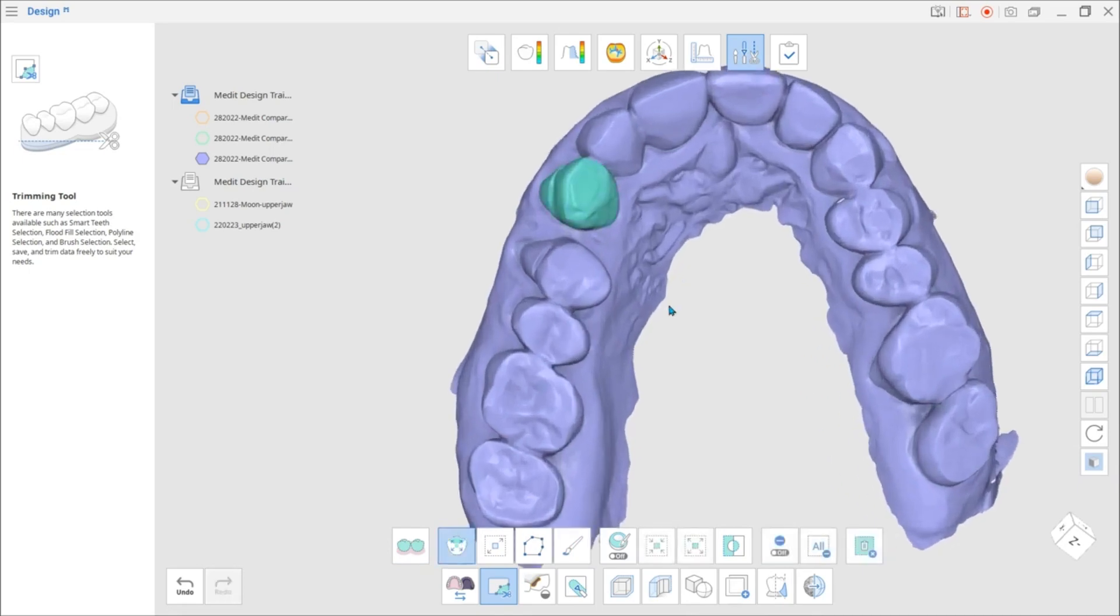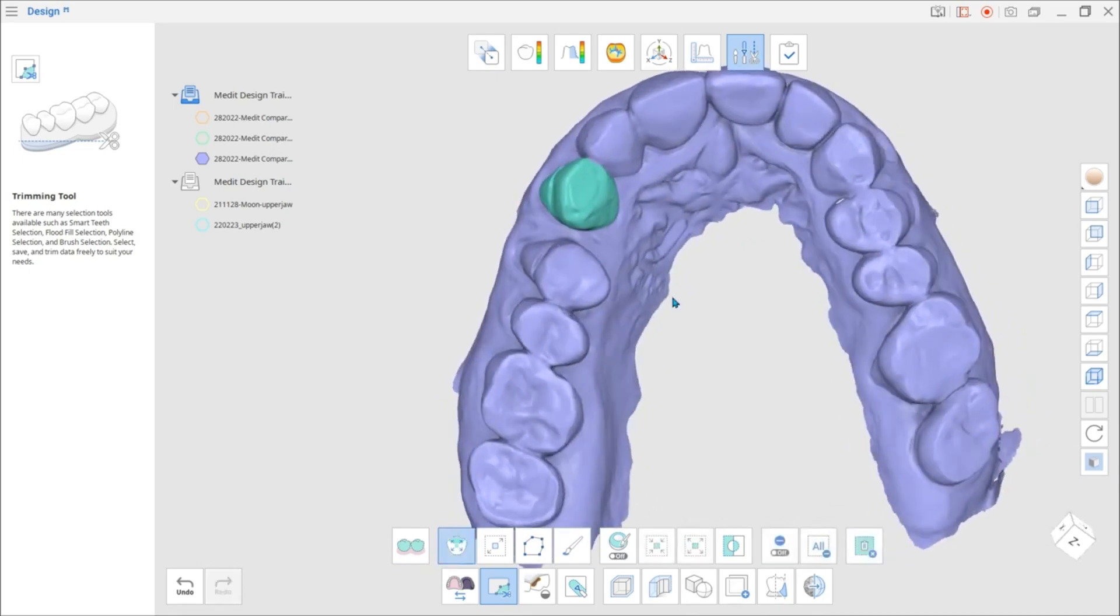Smart Selection can be done on all teeth of the arch or on a single tooth.